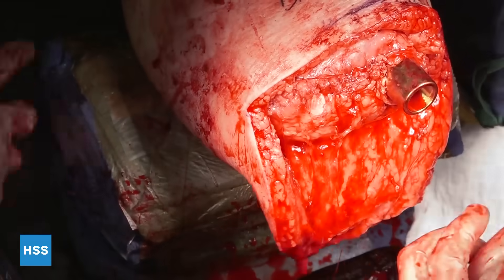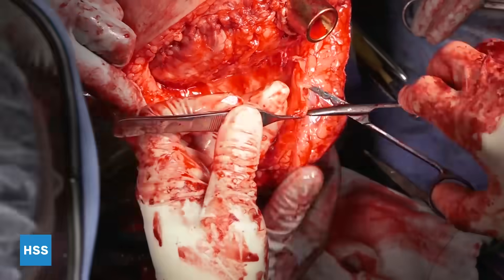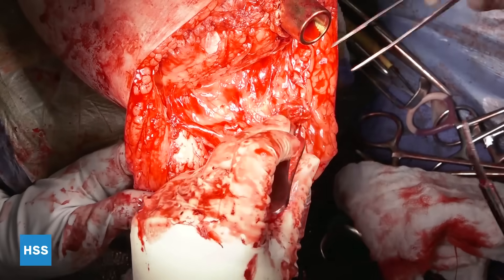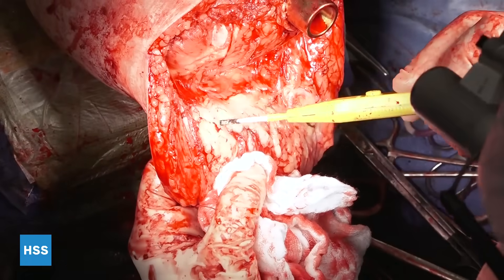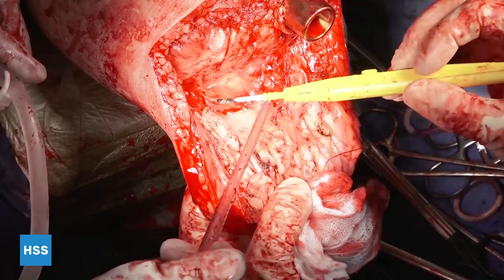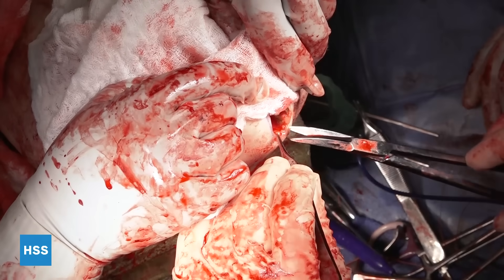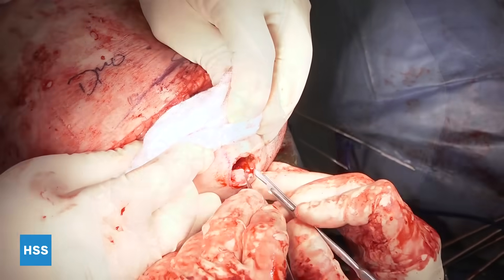With the muscle closed, you've got the posterior flap that has been separated from the muscle — that's important. The stoma is either created in the anterior or posterior muscle flap, typically it will be the posterior flap. You try to remove some of the subcutaneous fat — it's a balancing act: you don't want to remove too much because you can devitalize the tissue, but having less fat and less bulk at the stoma is an important principle. With the appropriate amount of tension, the posterior flap is pulled up and the stoma is being created. This is all done as a single stage surgery, which is one of the big advantages — right then and there you're optimizing the tension of the soft tissue to ideally create the stoma.